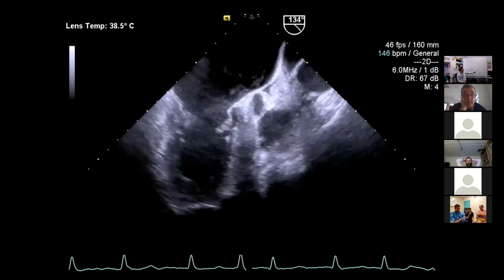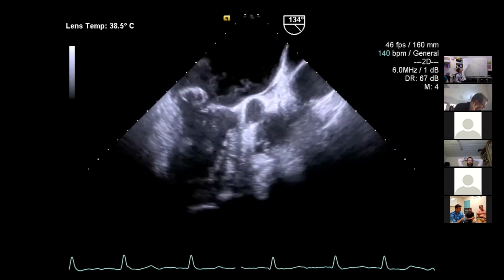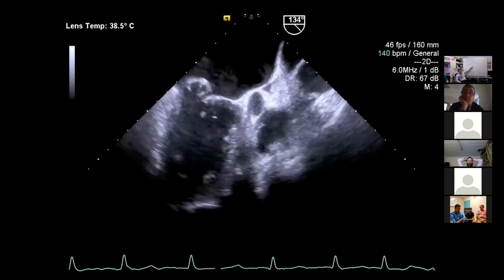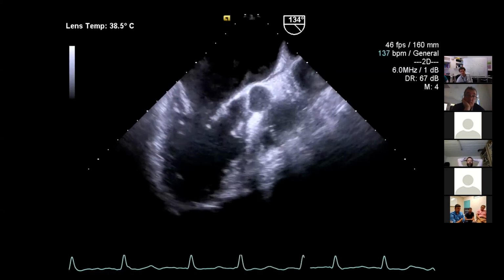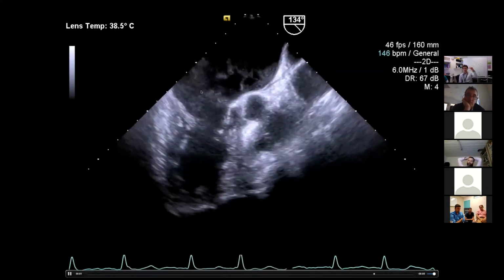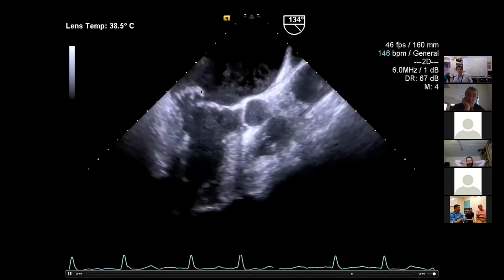And here we go, coming up to our sort of 3-chamber view. What we can see is the aortic valve at the top, just sort of coming in. A2 looks okay, which is this one here. And then the prolapsing one that looks like the claw is P2.